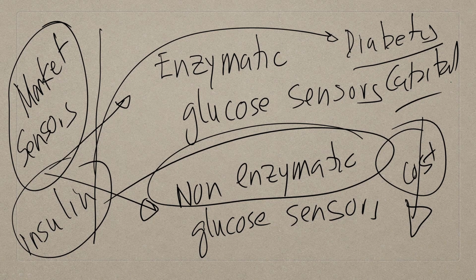This glucose sensor market is evolving. So, if you look at it, 60 years, modifications, improvements. We started with a simple reaction. If you recollect, glucose plus oxygen making gluconic acid and peroxide, right? The first sensor was how much oxygen is getting consumed in oxidizing glucose, which is being quantified by the Clark electrode.